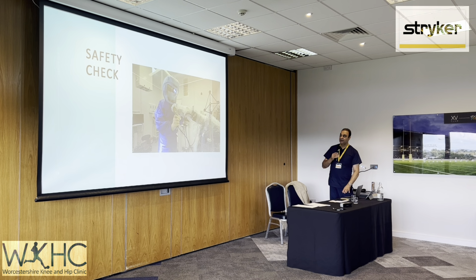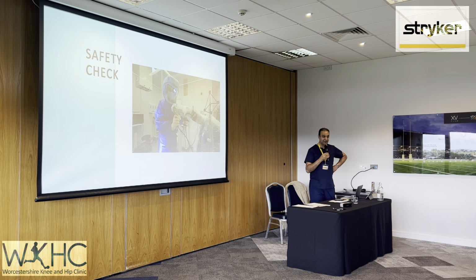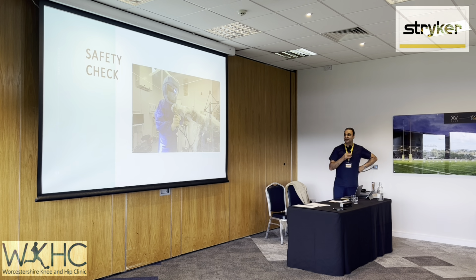And then you'll be careful with the robot. That saw is very sharp, it's a very rigid saw, so it's not flexible. So if the saw is not tucked in and the scrub nurse walks past, there is a risk that you could cut her neck. In one of our early cases, it nearly happened. We had a scrub person who walked past and it just missed her neck, unfortunately.